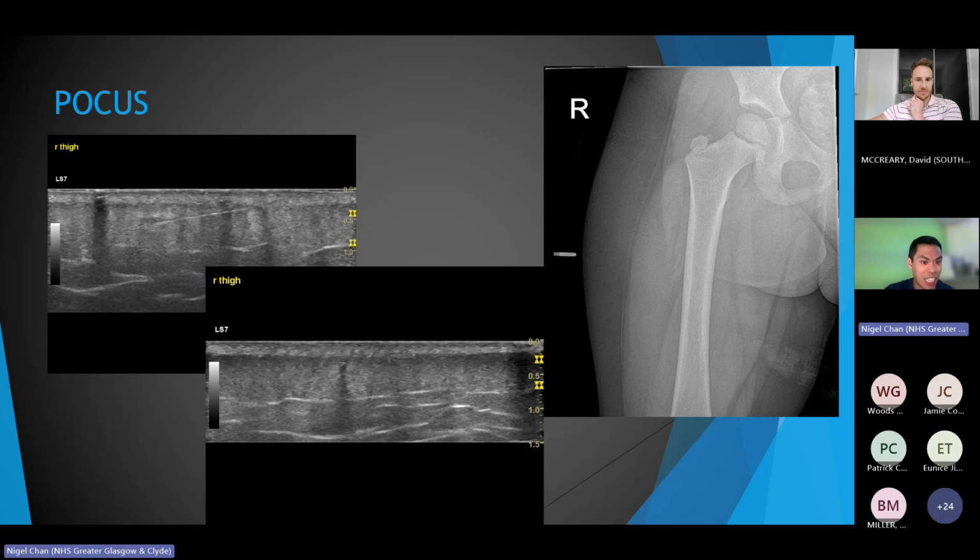And this is just looking at it in short axis. You can see at the very beginning of the clip the shadow that it casts here, that black bit. Which again, you couldn't see on X-ray. So that's what wood looks like.